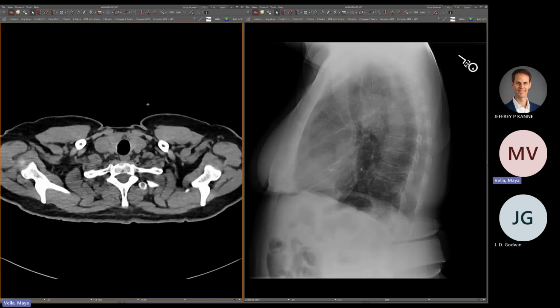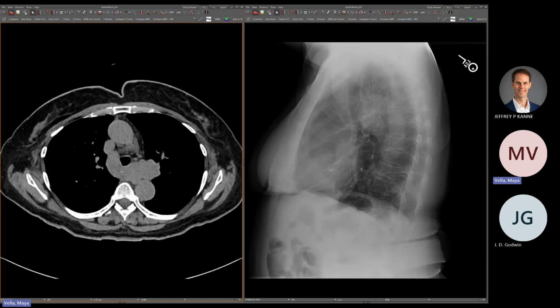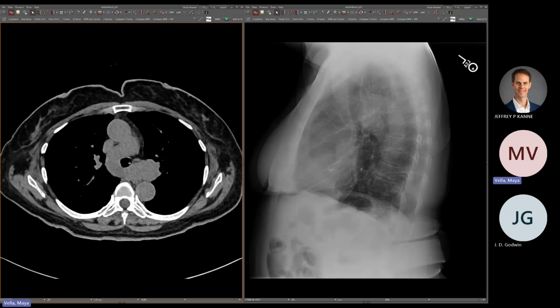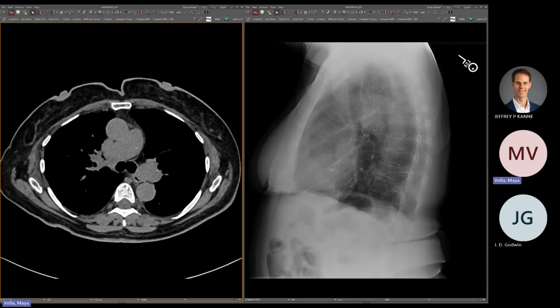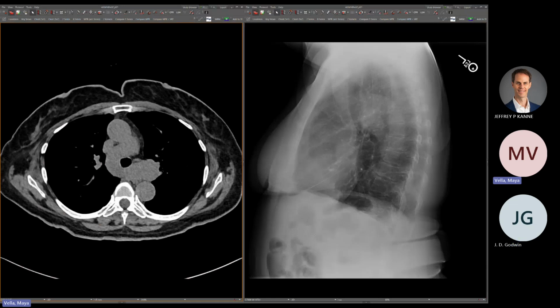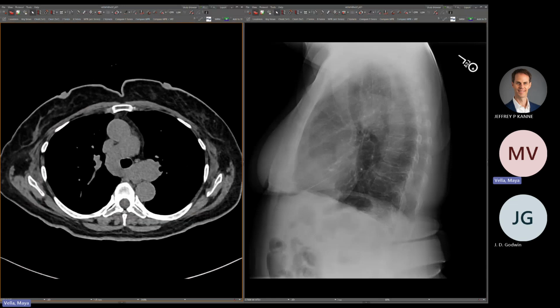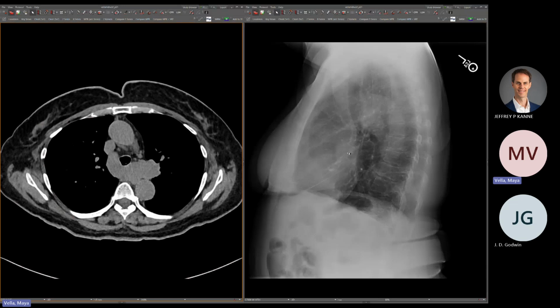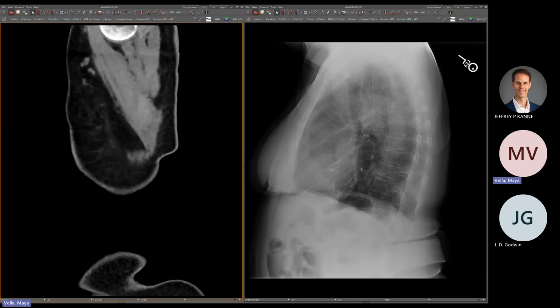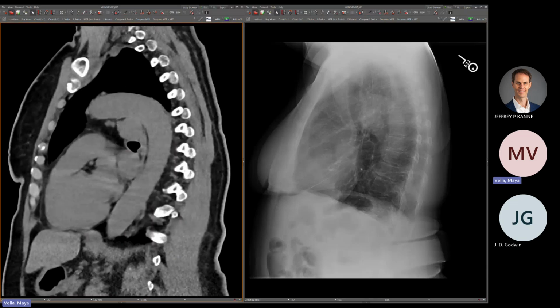Unfortunately, it was non-con, but still I think shows this pretty well. And what we see here as we come down below the aortic arch is this structure wrapping around behind the trachea and then coming across to the left hilum. So this is the left pulmonary artery, which wraps all the way around the trachea. Instead of going to the left of the trachea, it goes to the right and then wraps behind. So it looks like a pulmonary sling morphology, which corresponds nicely to that sort of rounded density that we saw on the lateral of the chest x-ray. Just to compare, here's the CT of it, right? So there's our density right there.